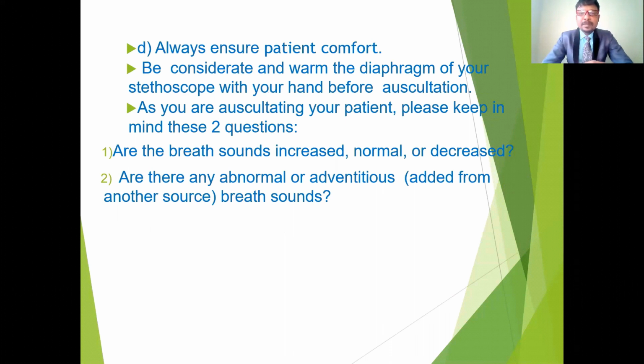Also always ensure the patient is comfortable, be considerate, and warm the diaphragm of your stethoscope with your hands before auscultation. If it is not warmed, it may interfere with the sound. That is why, before placing it, we rub the diaphragm of the stethoscope so that we can hear a clear sound.